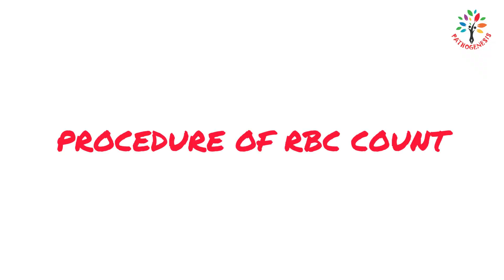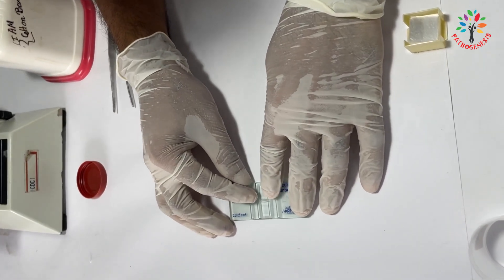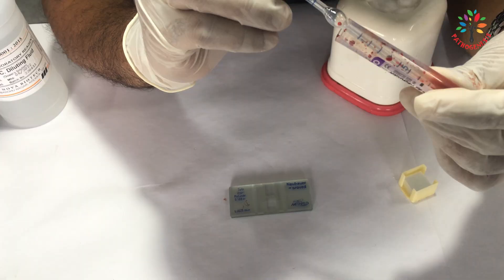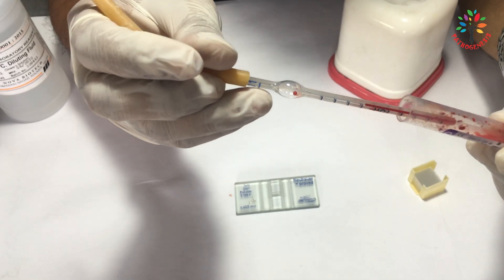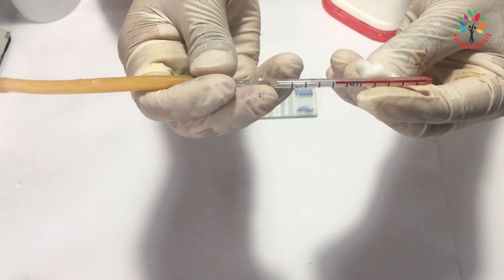Now let's talk about the procedure. First, keep the Nuber's Chamber ready by placing a cover glass on top of it. Take the EDTA blood sample and mix it. Take a clean RBC pipette and transfer the blood up to the 0.5 mark. Wipe the outside of the RBC pipette to remove extra blood.